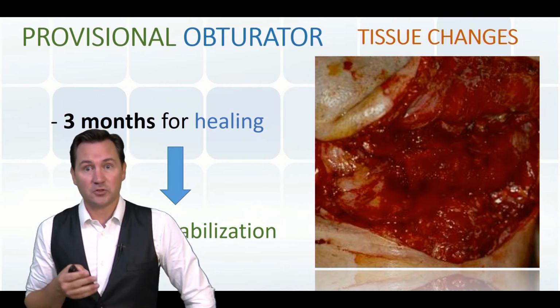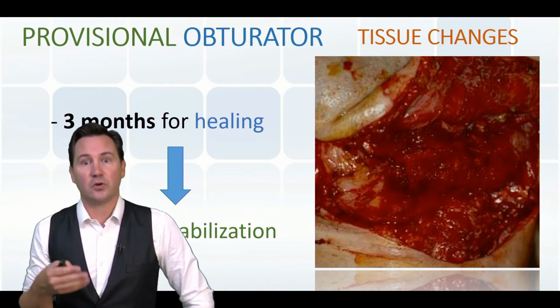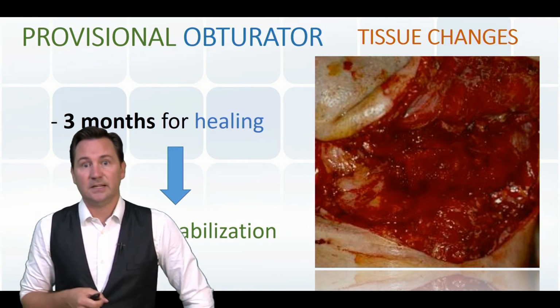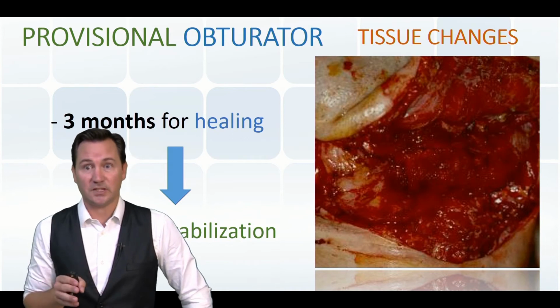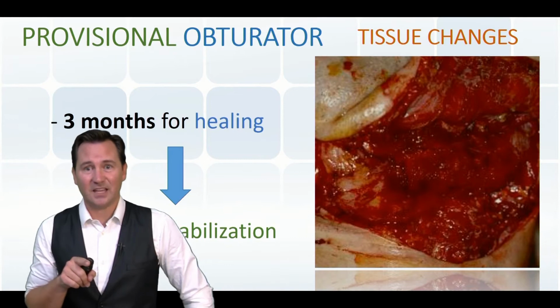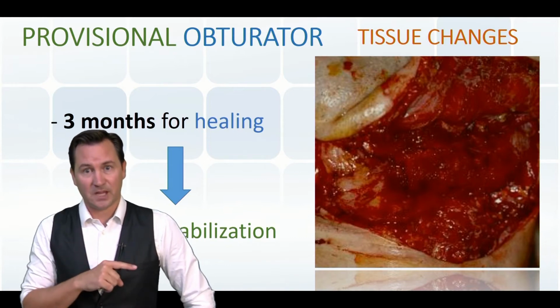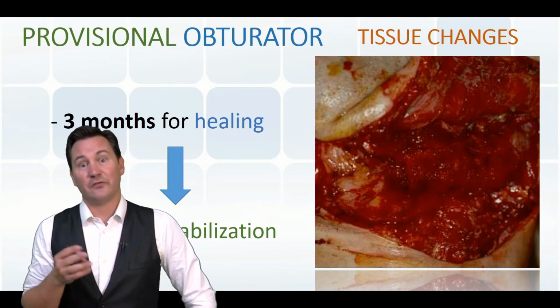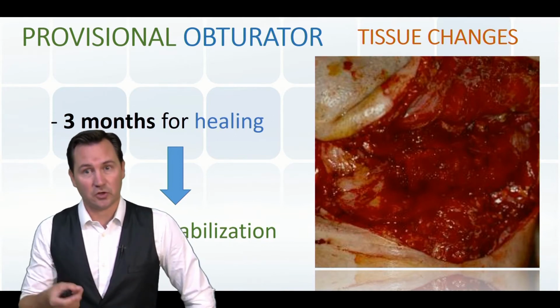Sometimes a surgical obturator or a former prosthesis can be relined and turned into a provisional obturator, if it was functional enough. Sometimes also you can find in the literature another category of obturator. It's called the post-resection obturator. In this case, the impressions are made at the end of the removal surgery, while the patient is still asleep in the operative room. So the fabrication of the obturator is then similar to a provisional obturator.